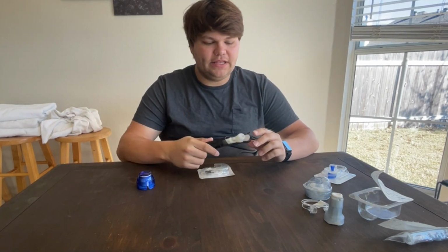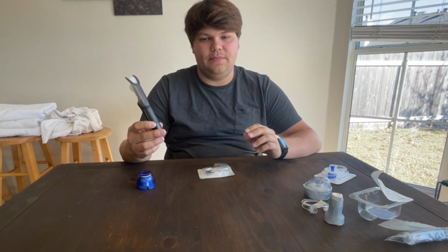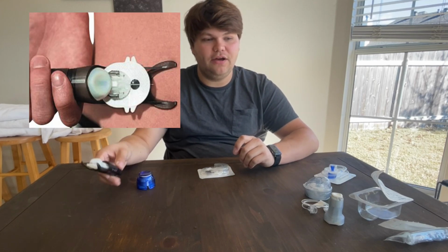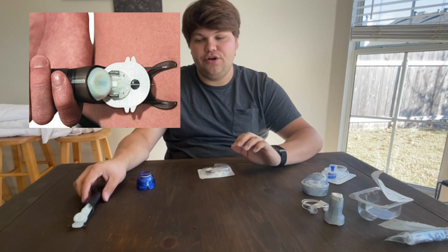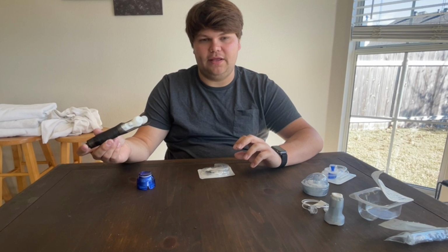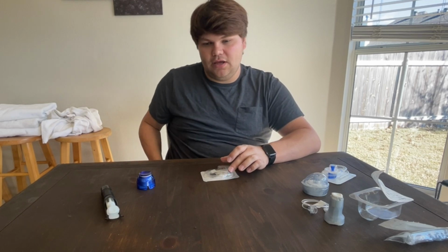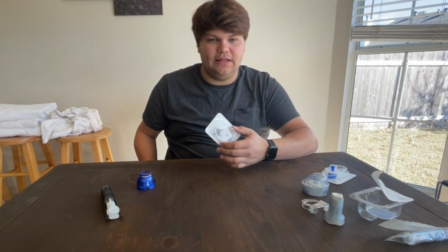But the Silhouette allows me to put my pump on my leg, and in doing that, the angle of the infusion set is at like a 45-degree angle instead of the 90-degree angle for all these other sets. So I don't have to worry about blockages and problems with insulin delivery with these. I currently have this on. My pump is in my pocket, and the infusion set is on my leg.